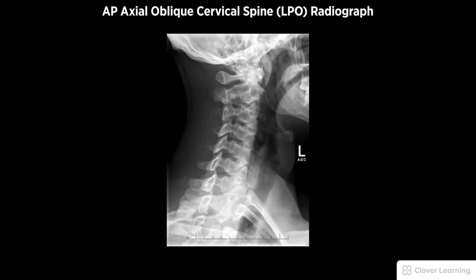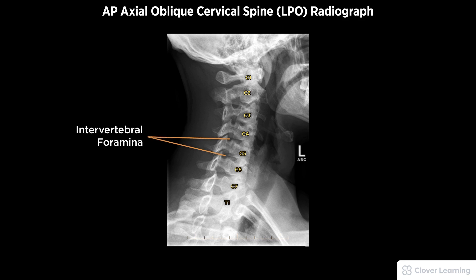A diagnostic AP axial cervical spine left posterior oblique LPO radiograph must be free of motion with a 45 degree rotation. Demonstrated anatomy to include seven cervical and the first thoracic vertebrae, the open intervertebral foramina furthest from the image receptor, with proper visualization of soft tissue and bony detail.